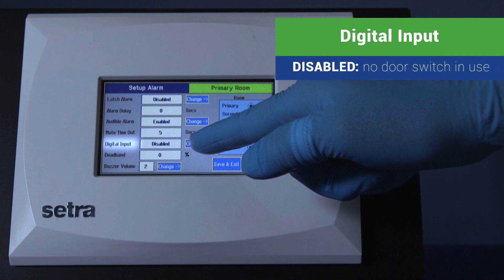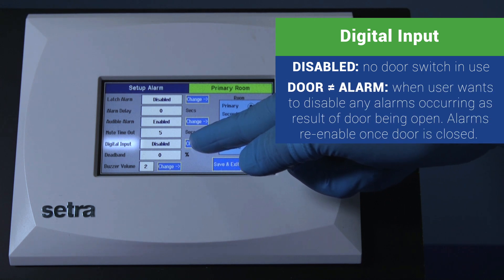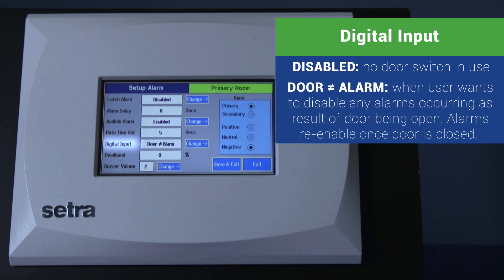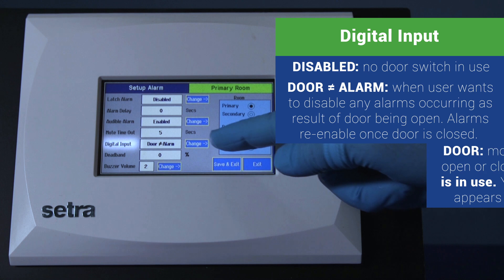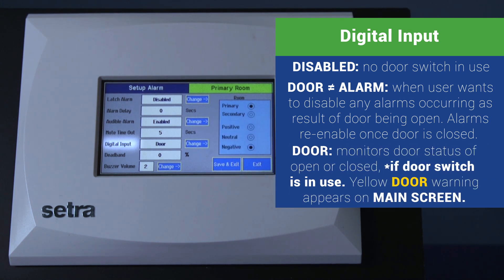Digital input — disabled: no door switch is being used. Door does not alarm. This function is used when the user wants to disable any alarms that are occurring as a result of the door being open. The alarms will be re-enabled once the door is closed. Door: this monitors door status of open or closed. If a door switch is being used, a yellow door warning on the home screen will show.